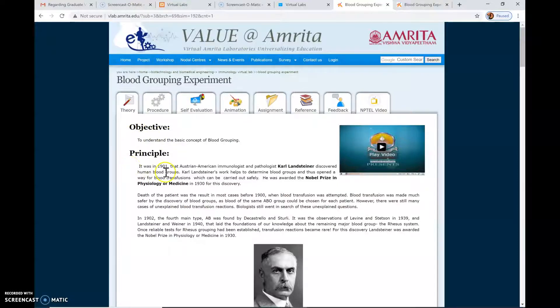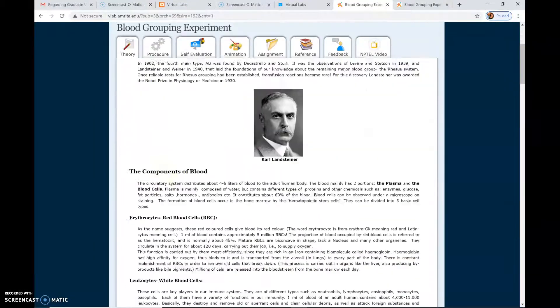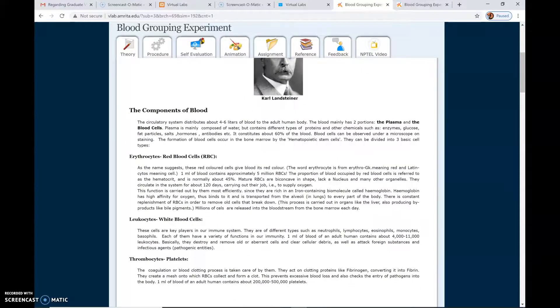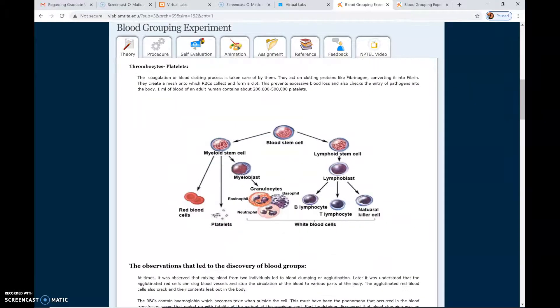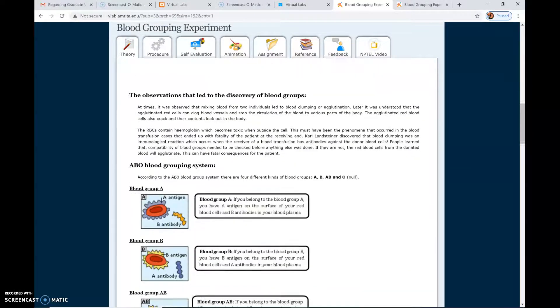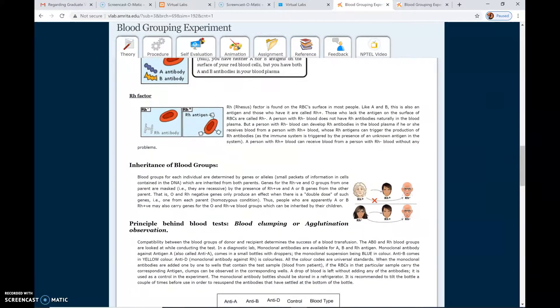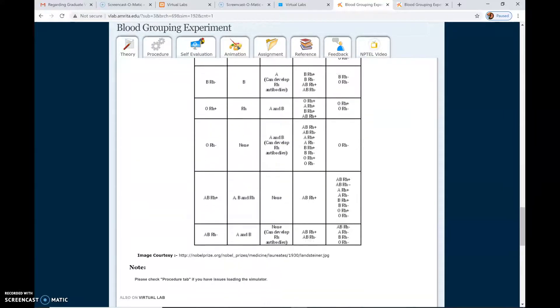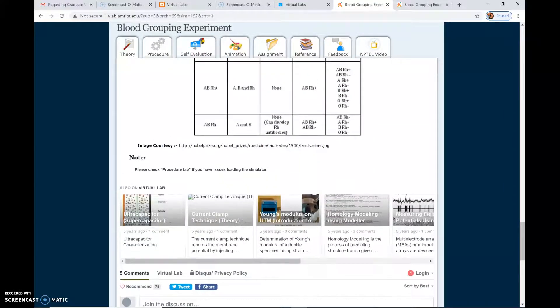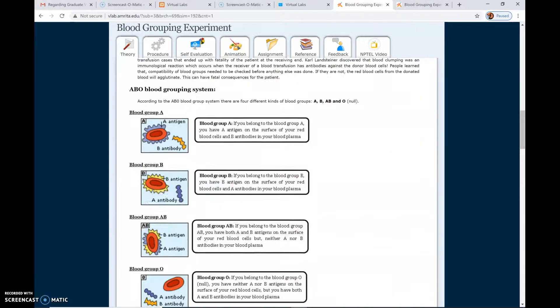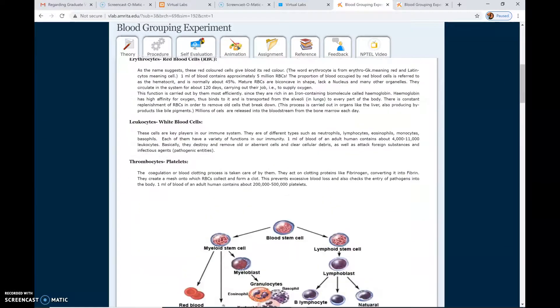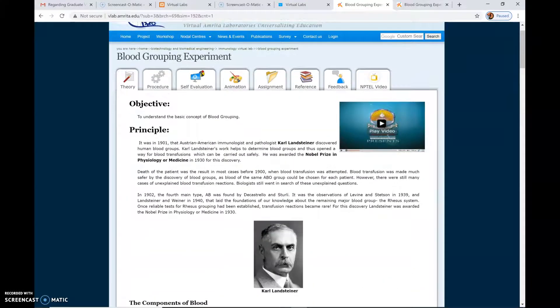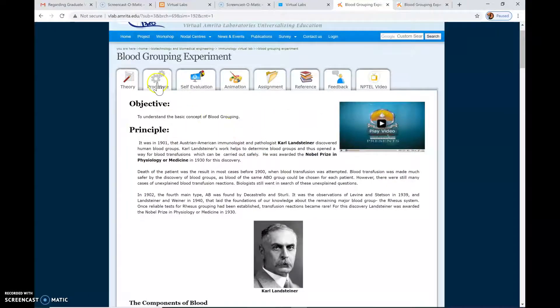First, you must go through the theory. You can study the objective, the principles, the history behind this, and more theory is given here. Please go through all this theory, which we will discuss during the practicals later. Once the briefing regarding the theory behind blood grouping is done, you can play the video available here.